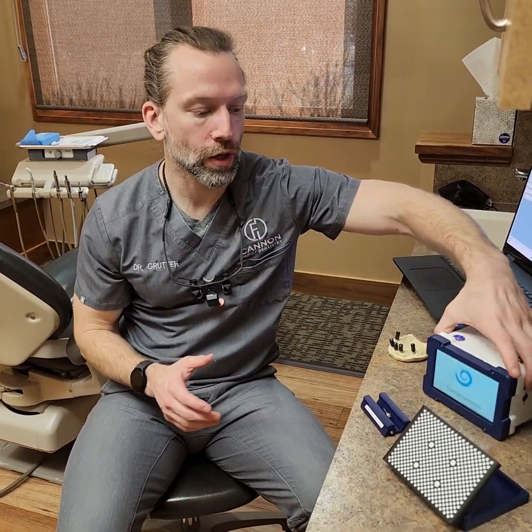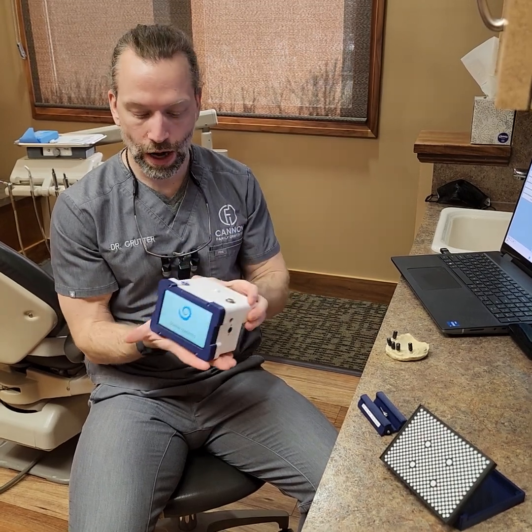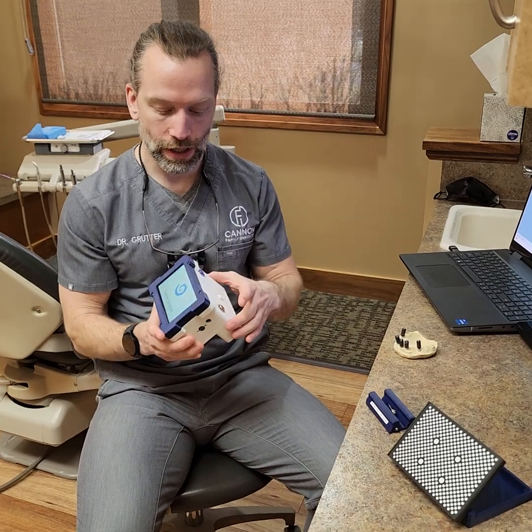I'm making a quick video to show Blue Sky Bio's new photogrammetry unit. It's pretty small, compact, about the size of my hand, quite lightweight, and very simplistic in functionality. It does a great job from what I'm seeing, and I see a lot of questions out there about what's the deal with this.